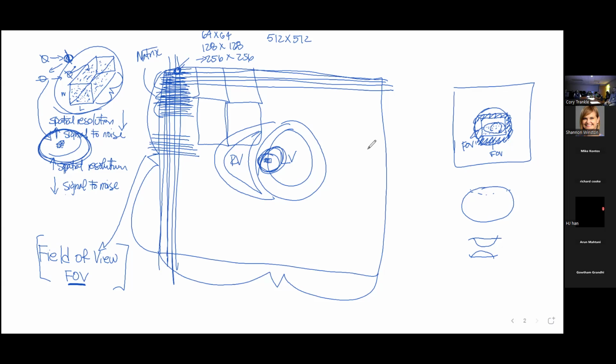structures. Okay, so in review today, we talked about how we're making these images. We're imaging protons. Most of them are bound to oxygen in water or carbon in fat. We're going to talk about, in lecture 4, tissue characterization. One of the most fundamental pieces of tissue characterization is discriminating fat from water. In cardiology, you can have a tumor in the heart. Is that a lipoma? You see a mass on echo in the wall of the atrium, and it's lipomatous hypertrophy of the interatrial septum. That's one picture. Boom, fat or water right there in the interatrial septum. Okay, so it's a simple form.